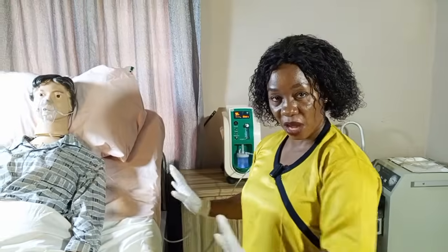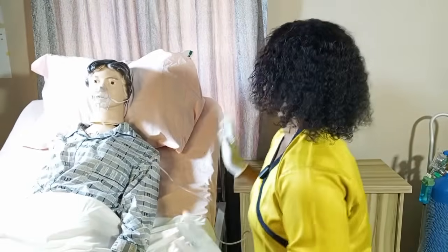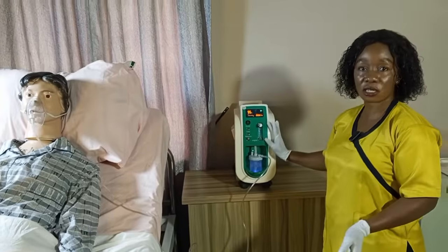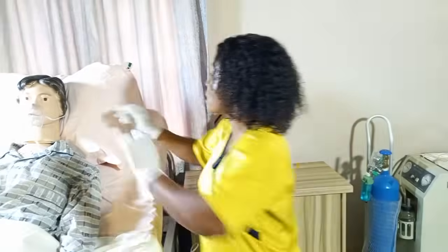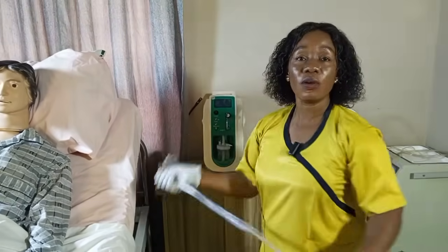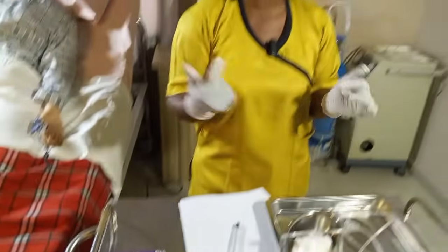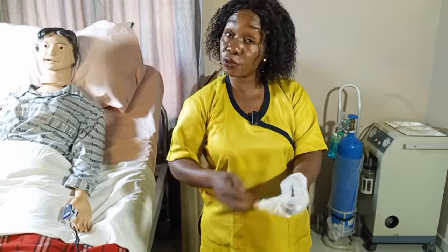But if it is during OSCE, after demonstrating that you have administered the oxygen, you tell your examiner that the patient's oxygen saturation is now normal, so you can disconnect the oxygen. Immediately turn off the oxygen concentrator because the demonstration is done. Disconnect the tubing. Tell your examiner you are discarding used equipment by rearranging, because the next candidate is coming in. Remove your gloves and go perform hand hygiene.